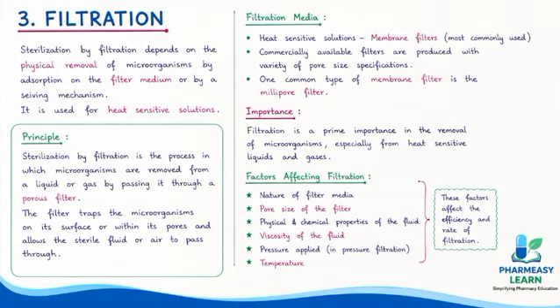Third is filtration. Filtration is different from heat sterilization because the microorganisms are primarily physically removed rather than destroyed by heat. This method is particularly useful for heat sensitive solutions that cannot safely withstand thermal sterilization. A suitable membrane or bacterial retentive filter is used to remove the microorganisms from the liquid. However, filtration requires careful control of the filter, the process conditions, and the handling of the sterile product to prevent contamination after the filtration.